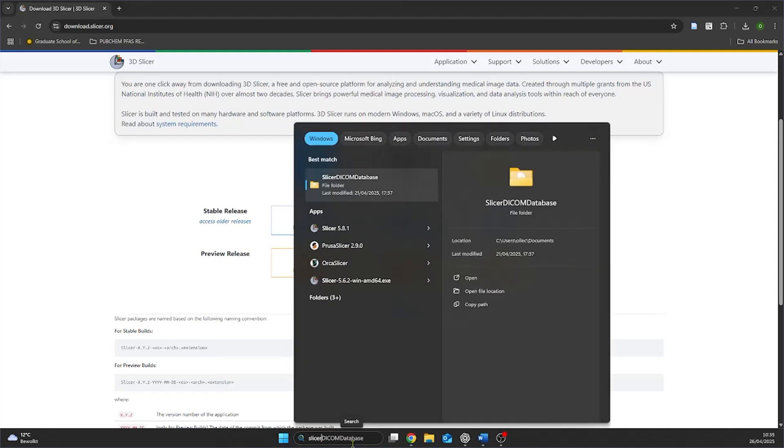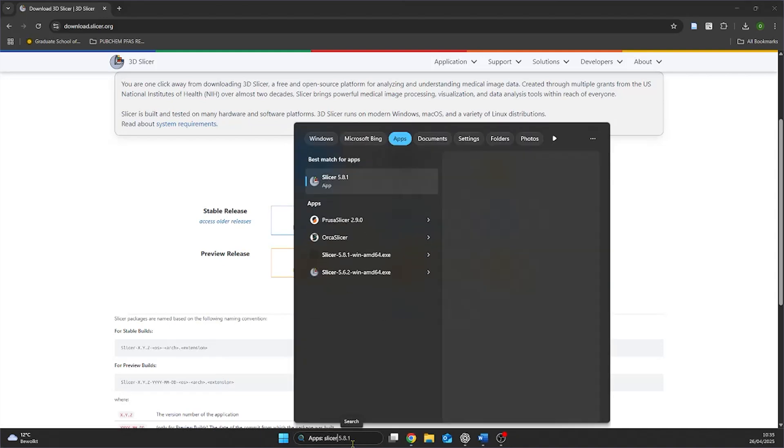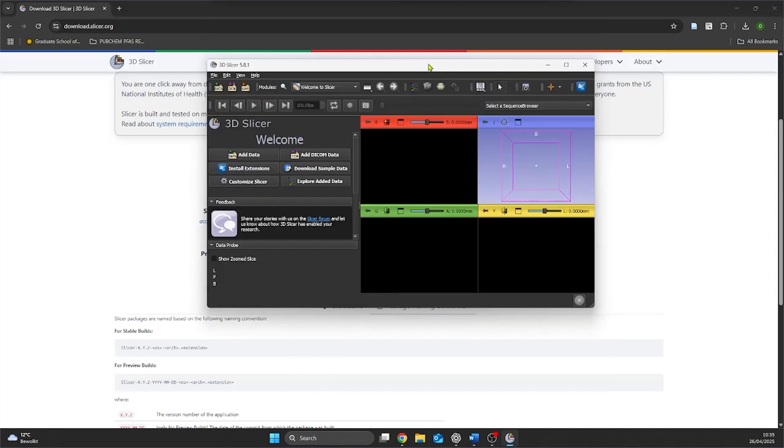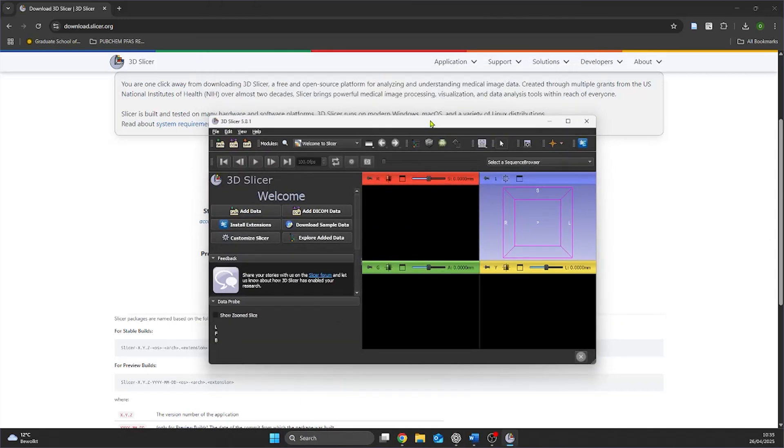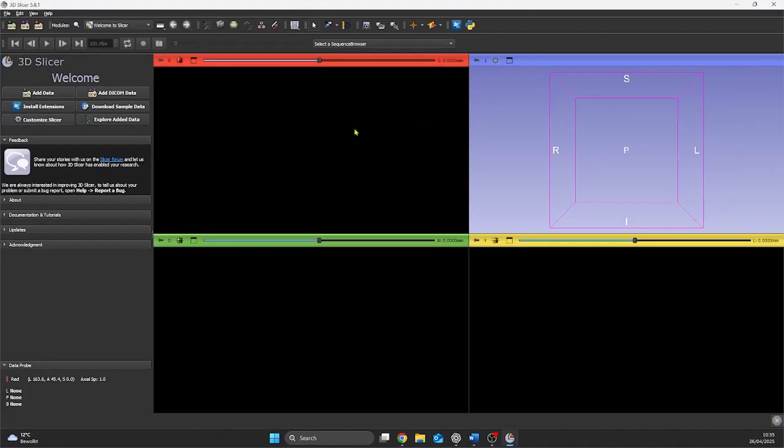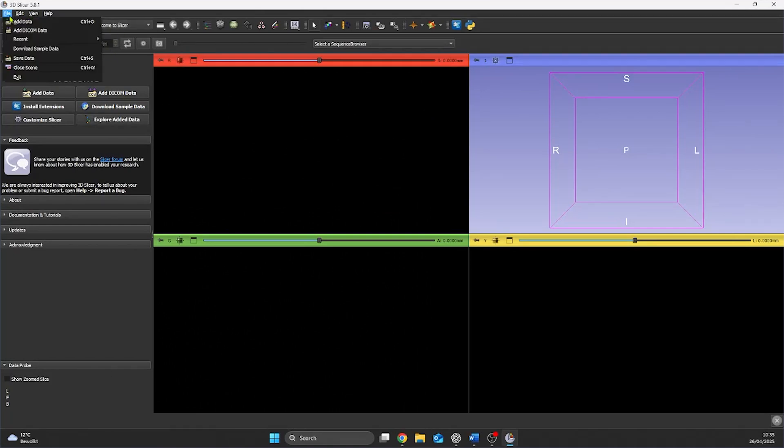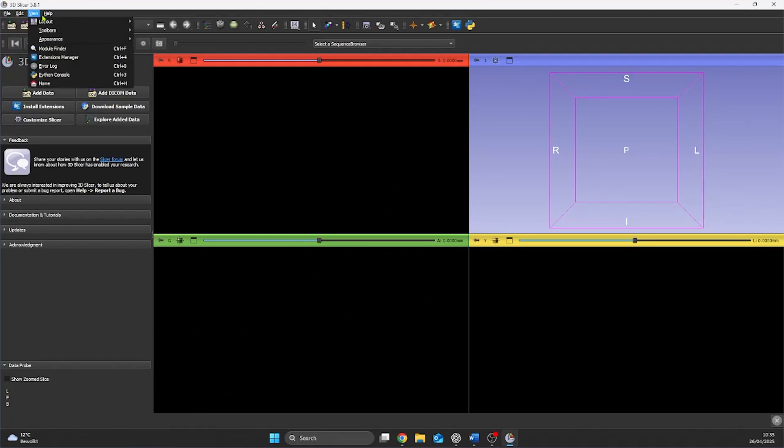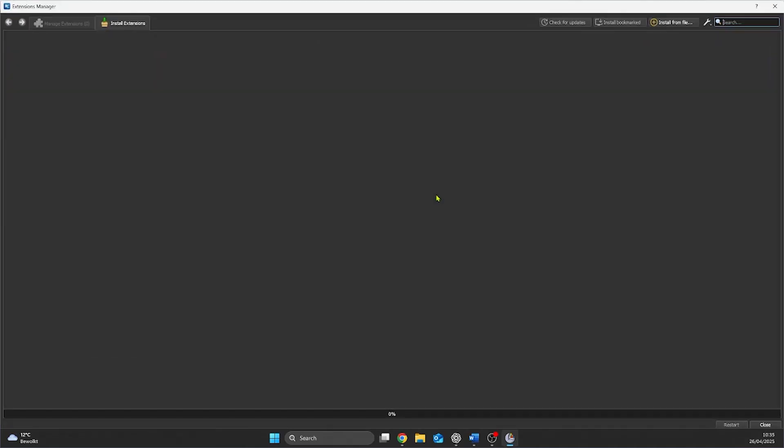After Slicer3D is installed we open it. Within the extension manager we can look for new extensions. In this case we're looking for the MONAI extensions. These are MONAILabel and MONAIAuto3DSeg. We can install them through the manager as well.